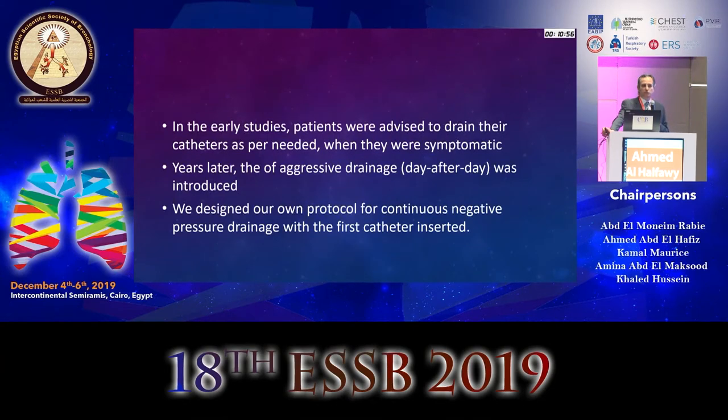When the company produced the catheter, they advised patients to drain it whenever they were symptomatic, whenever they felt breathless or had a cough. And now they're talking about aggressive drainage, which is a day-after-day protocol for draining these catheters.